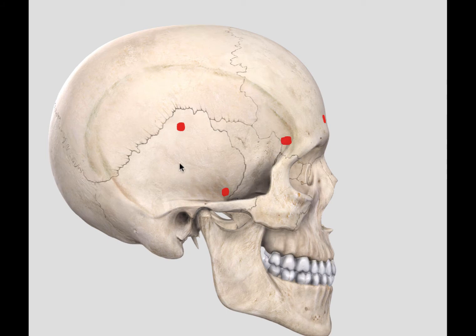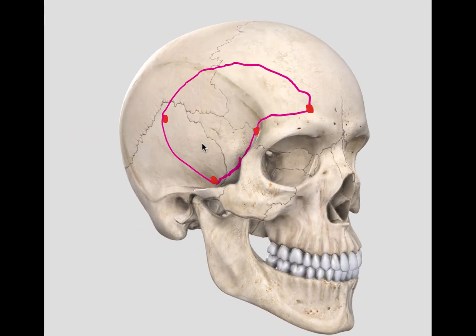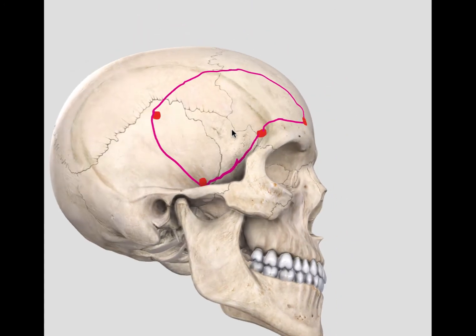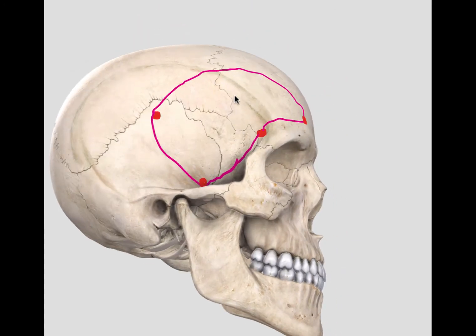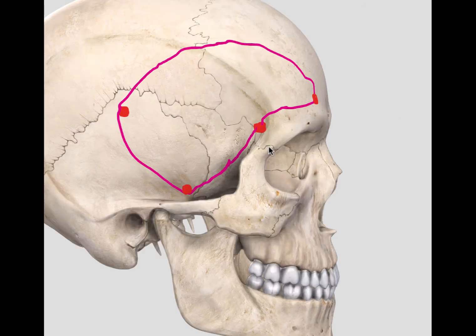Then I would connect up these burr holes to raise a cranial flap. We have connected the burr holes with a craniotome and I will raise this bone flap and put it to the other side. For the rest of the tutorial I will keep it there so that it's easier for you to orientate. The next step is to remove the orbitosygomatic complex as one unit.